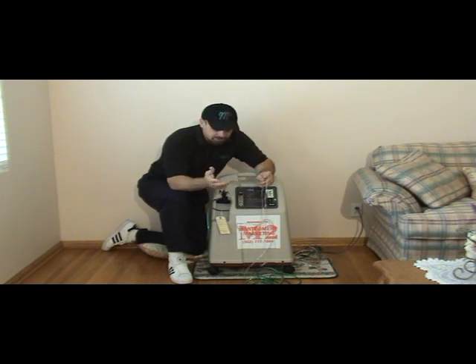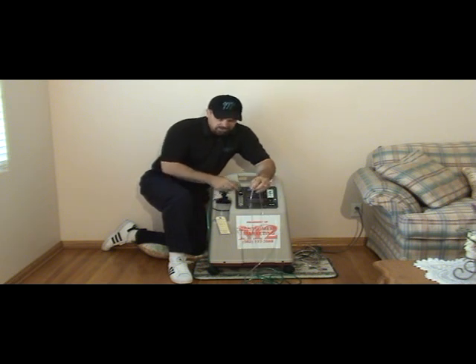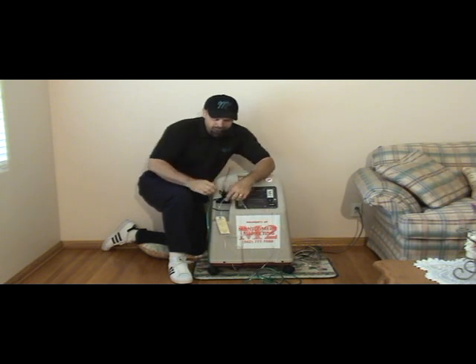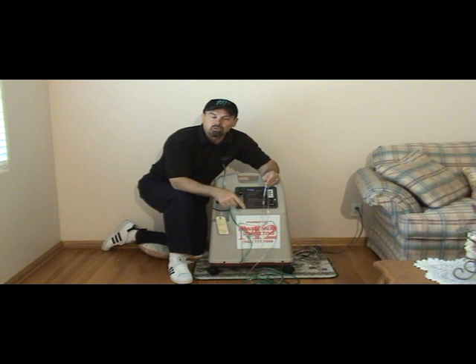But a secondary option is to bypass the humidifier bottle. And the way you do that is you disconnect the humidifier bottle from the concentrator, disconnect the extended tubing from the humidifier bottle, and hook it directly onto the unit, onto the concentrator. When you do this, there's still water in the line. If you run it that way for 24 hours, it will dry out the water in the line, and then you can go back to hooking it up the way it was before. Okay?